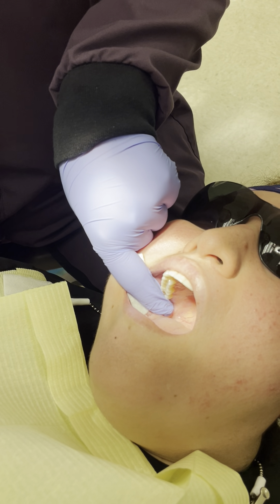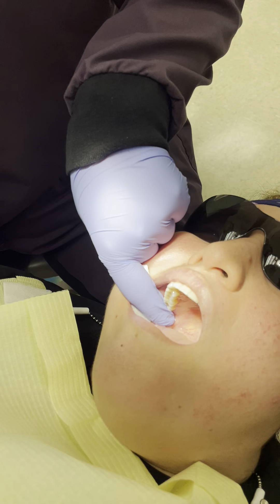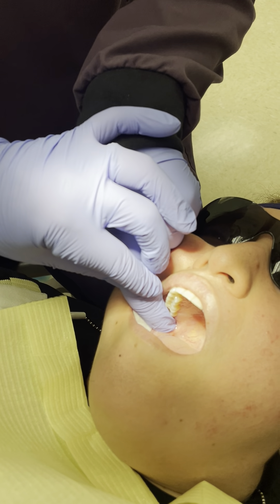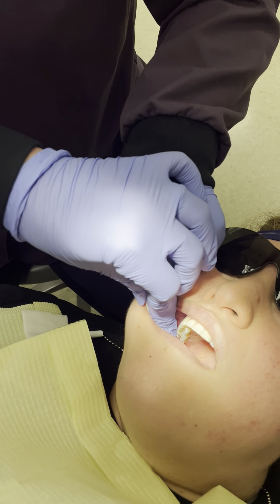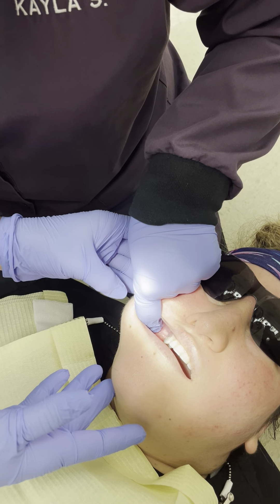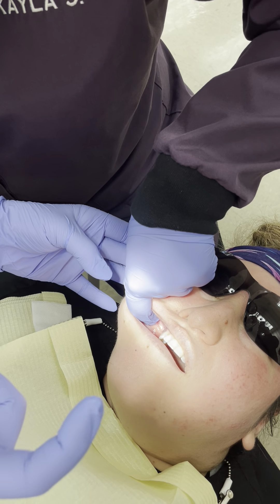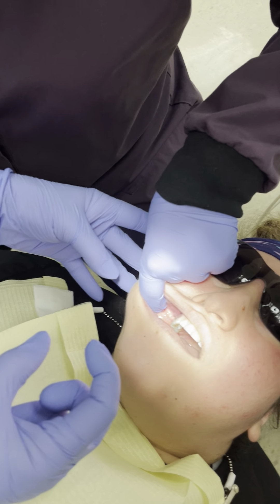The PSA retraction is really important — you need to get the vestibule wide open. You have to keep your finger way back, touching the maxillary tuberosity. Then you're going to literally slide your finger into the vestibule, keeping your finger way back. Then you're going to grab the cheek up high with your thumb and hook your finger forward, so you're kind of making a C with that retraction.